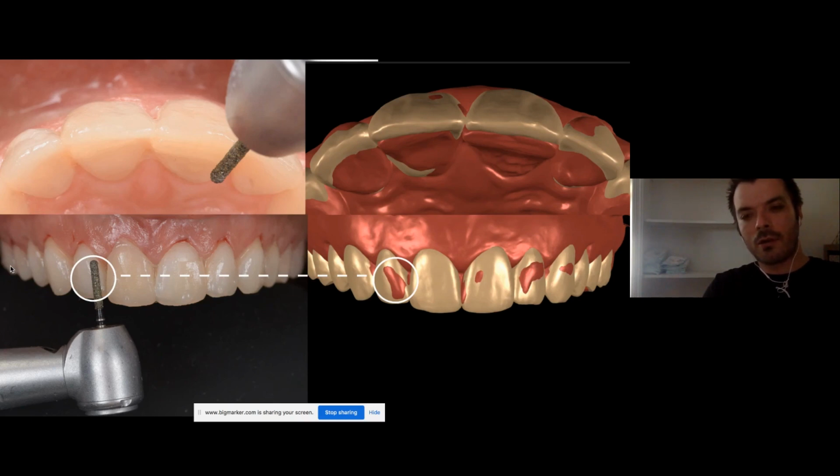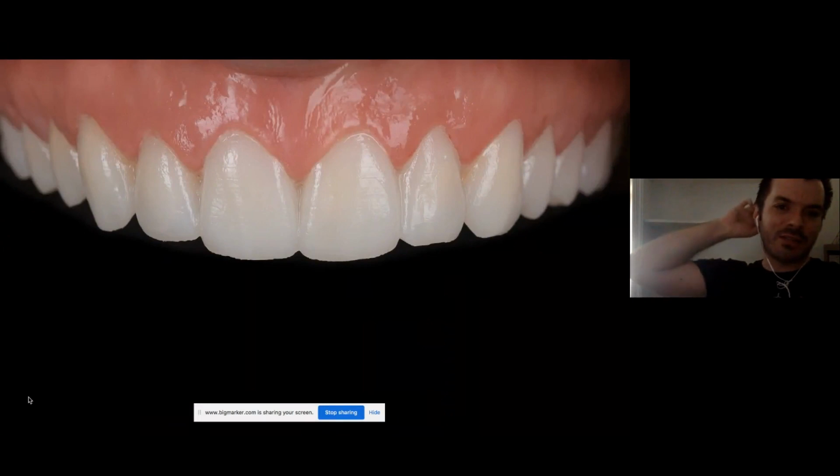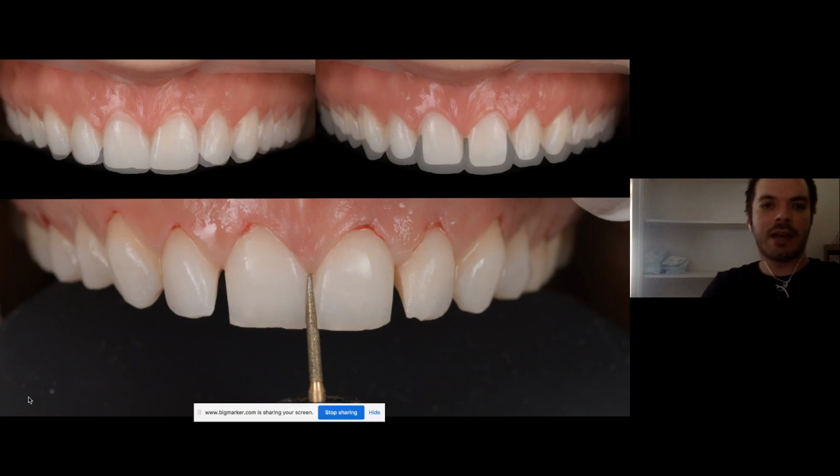As you get more experienced, then I open the file of the patient and I check this picture, and I just go in and cut. It's nothing very complicated. I just have to look, for example, at this lateral that you have to reduce from the mesial line angle. You want to do it with bisacryl or just visual, it's up to you. Once you do this, you can transfer the library in the ideal position. And then after you do this, then it's normal dentistry. You prep according to the drills from this point on.